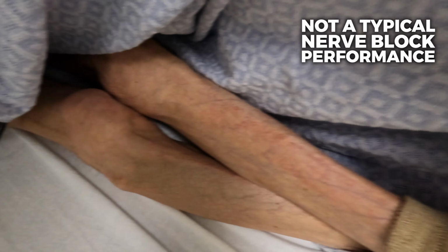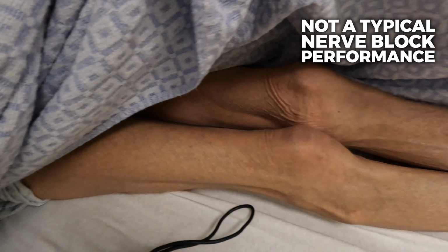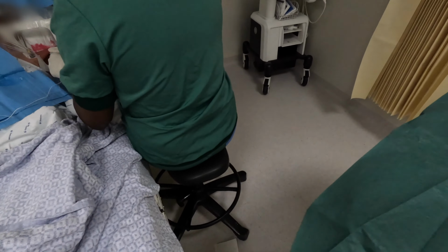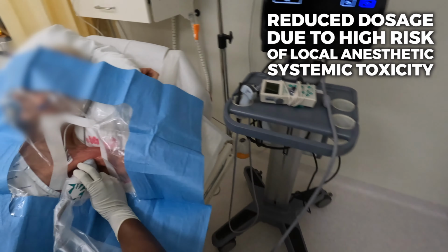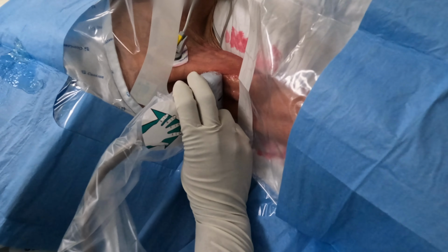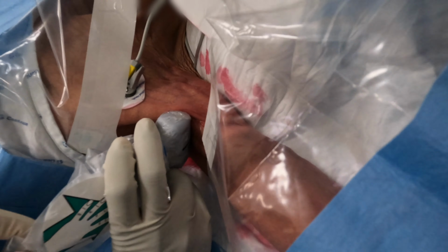So this will not be your typical axillary block with 20 milliliters of local anesthetic. Rather, these are patients who are at a high risk of local anesthetic systemic toxicity. So we're going to reduce the dose to probably half, and the chances are we will not even need more than that. So everything is prepped and draped here.